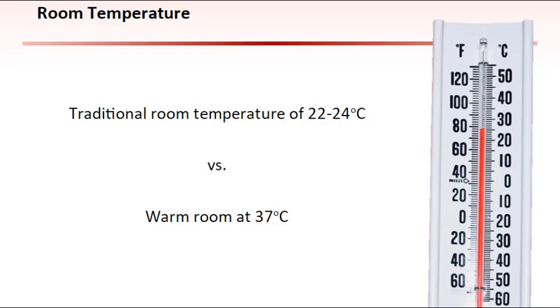Certainly, there are tolerance limits for equipment, and many devices are designed to be used at traditional room temperatures. Incubators, for example, have systems in place to increase their temperatures, but have nothing that is designed to actively cool, except for passively turning off the heating elements when the designated temperature is met. Thus, equipment continually used in hotter environments may have a shorter lifespan than equipment used at the temperature for which it was created and tested. However, any discussion of this nature is speculative.